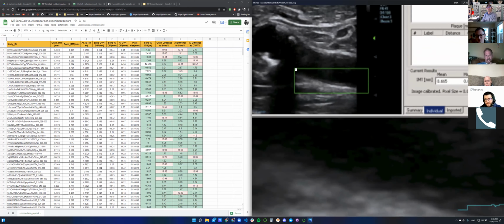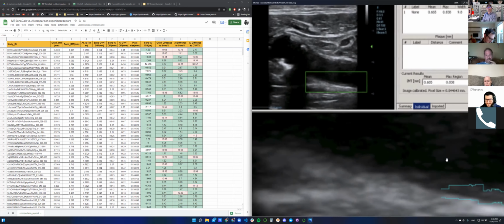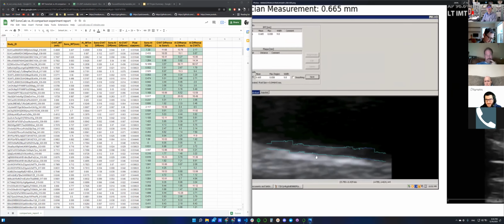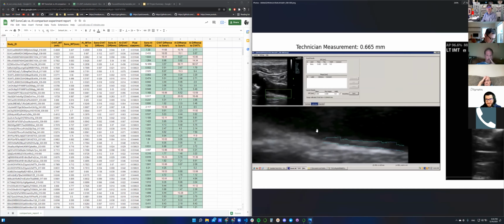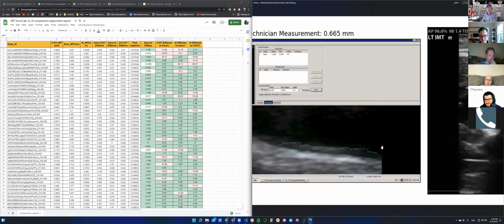Yeah, well, I think it's reasonable for that to be 10 millimeters if we think about the pixel size. I think if we can do the math, we can find out if that's the case. Because if you think about it, the IMT measurement, the mean thickness measurement, is usually like 0.8 or something like that. So I think it's reasonable for this distance to be 10 millimeters.